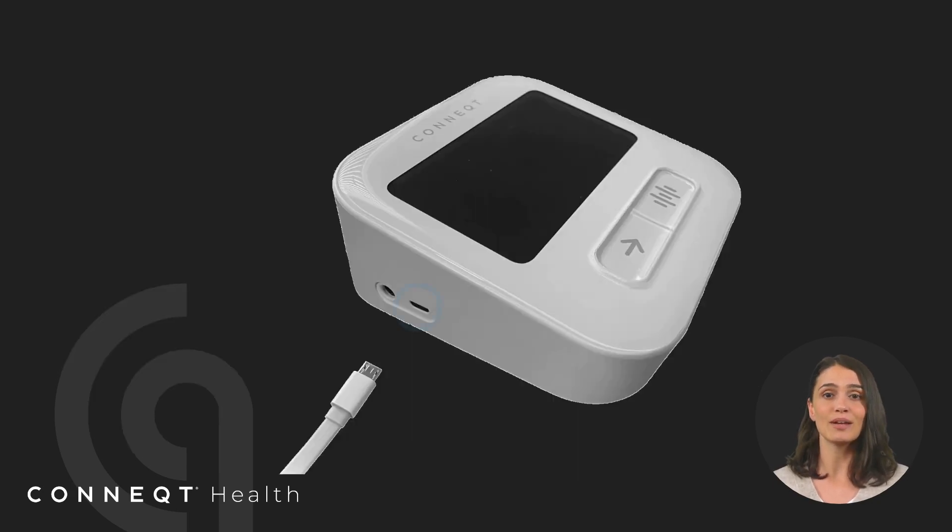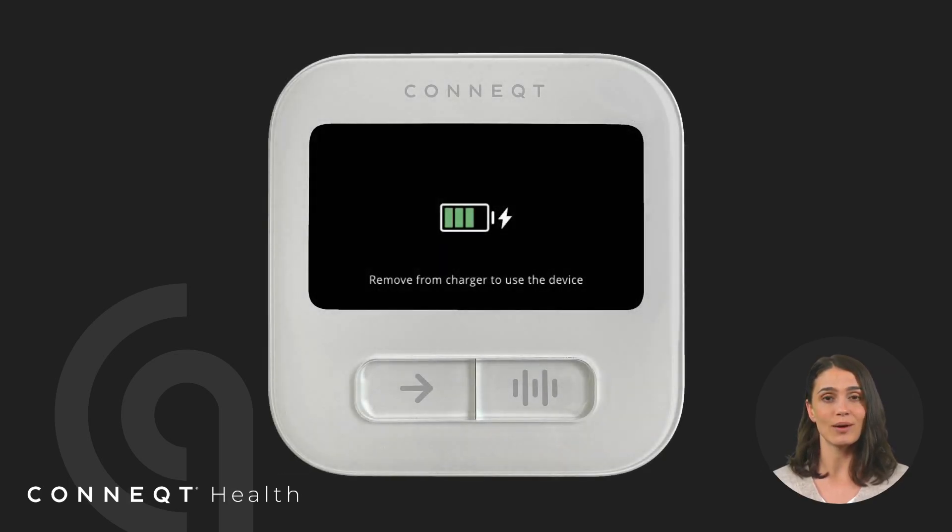Before using your Pulse, make sure to fully charge it. Use the charging cable included in the box, connect it to the Pulse, and then plug it into a power source. For best performance, let the device charge completely before using it for the first time.